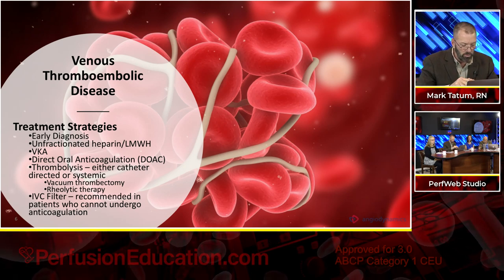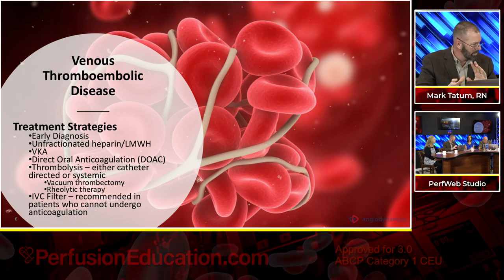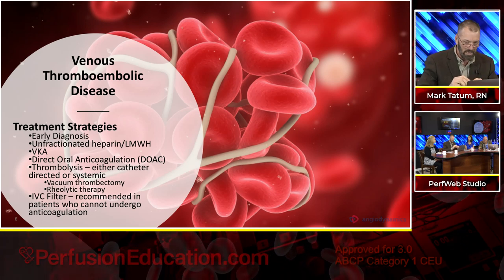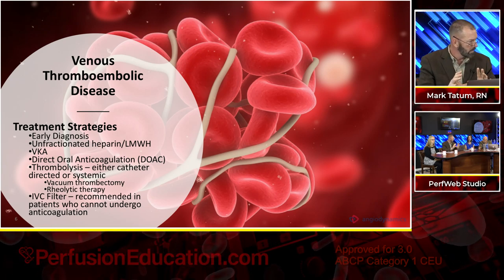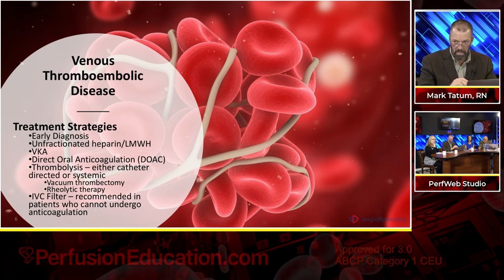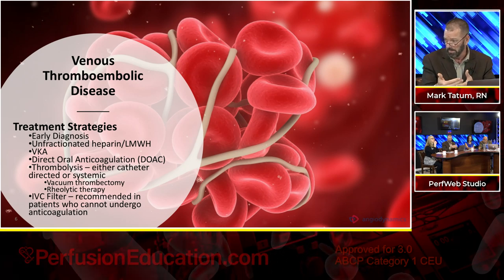I do want to mention just a couple of other things. IVC filters, something that is becoming less and less in vogue in this country. In 2014, there were roughly 250,000 IVC filters placed in the United States. Wow. If you compare that to Europe and others, they placed about 9,000 in that same time period.